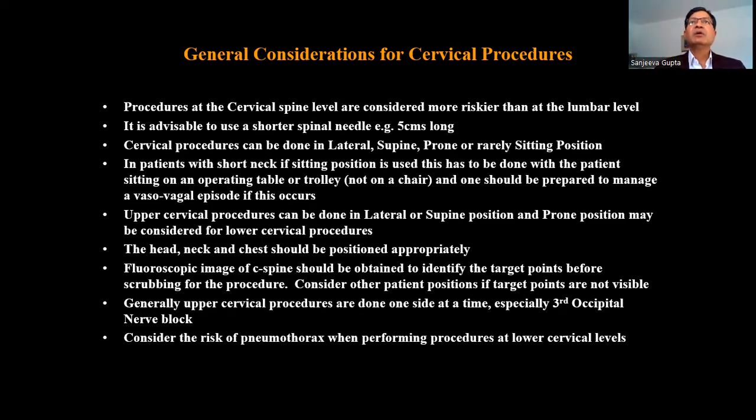As a general rule, I prefer to do cervical procedures one side at a time, even if it is upper or lower cervical medial branch blocks. Clinically, when you're examining these patients, it may be important to identify the side. Patients sometimes say that the pain is coming from both sides, but if you carefully analyze the pain, you will be able to pick up which side is more of a problem and do that side first.